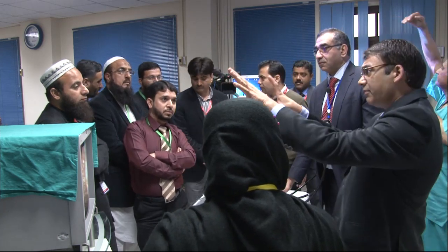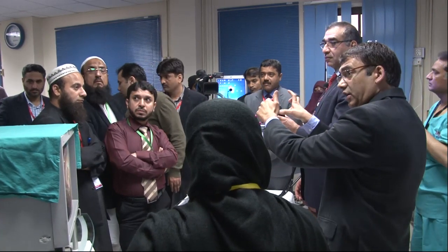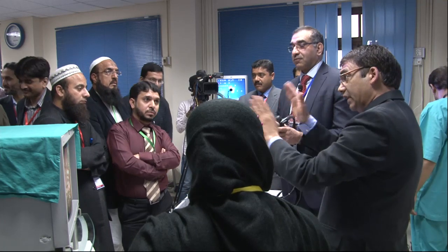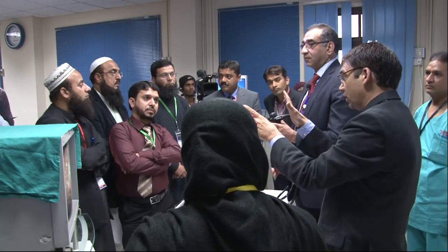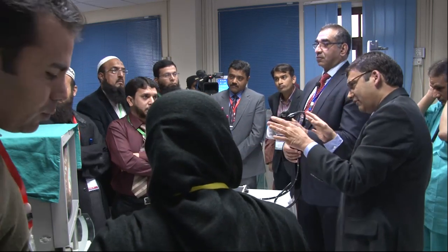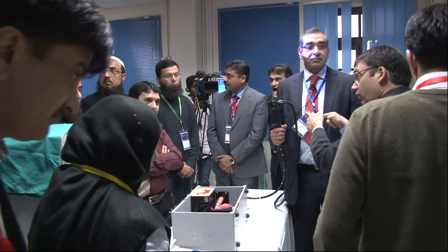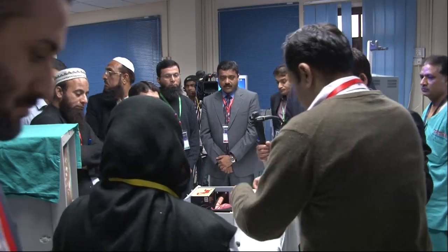If there is a camera which can show the position of the endoscopist and the movement we make, pay more attention to that. People keep looking at the screen, especially those who are observing. And it's very important, because you see the papilla, everything looks fine, but you don't know what movements were taken. That's very important.